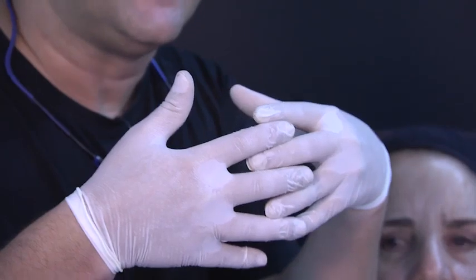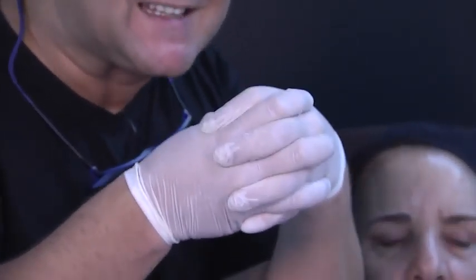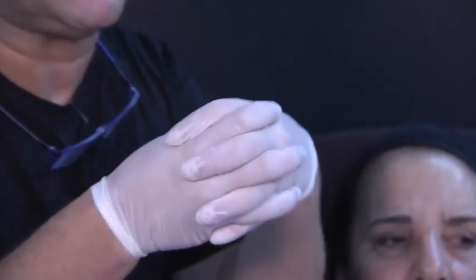You understand? There is more space for water retention in a linear or OBT than if I am more compact. There is less space for water retention. That's the reason why NASHA retains less. Because she has a severe tear trough, I'm using Restylane, okay?